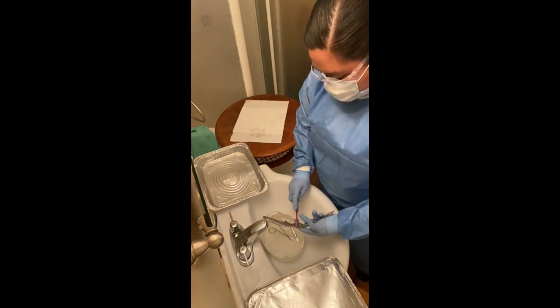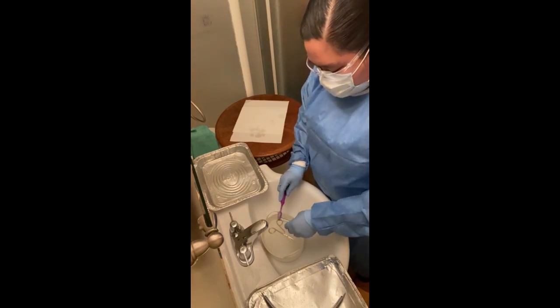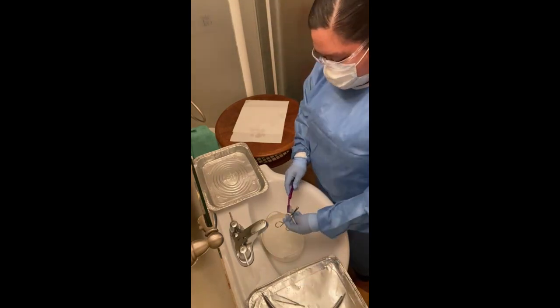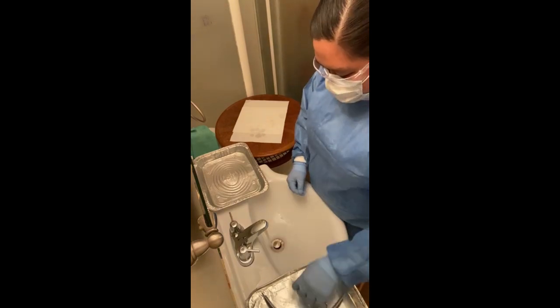Scrub instruments manually using a brush, soap, and water. Thorough cleaning removes organic debris and biofilm, reducing the microbial load before sterilization or disinfection.